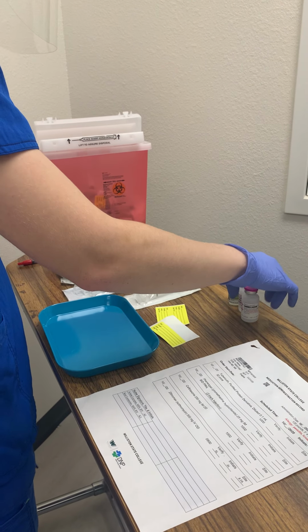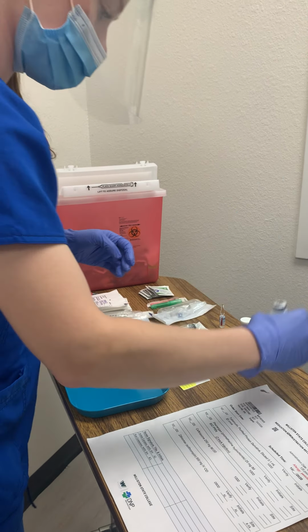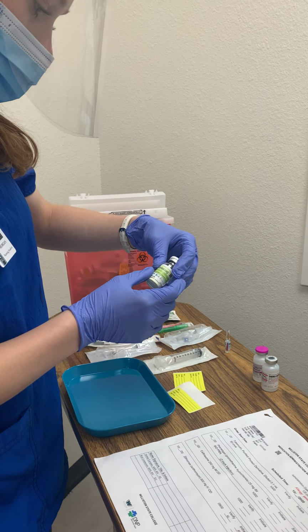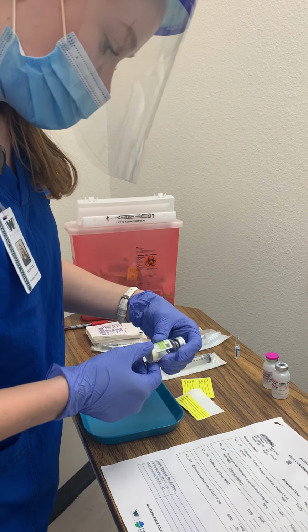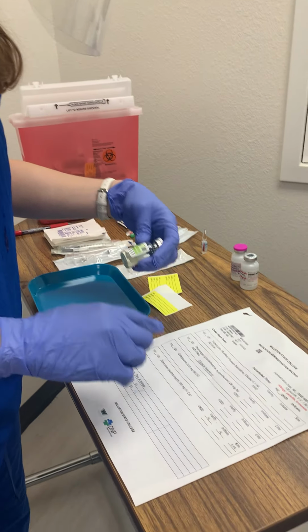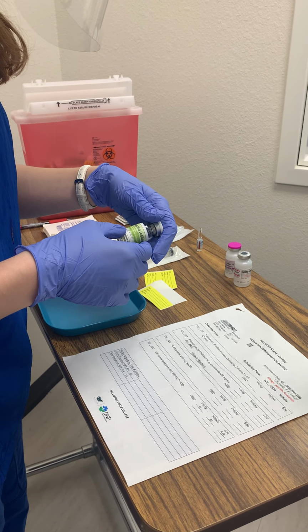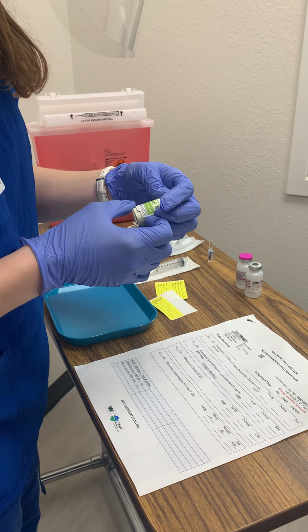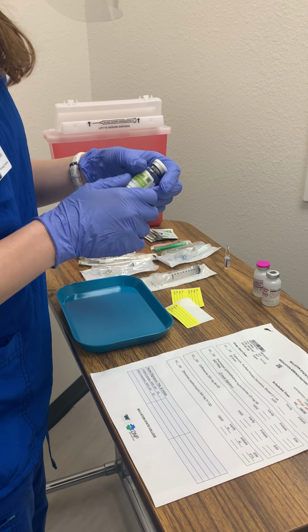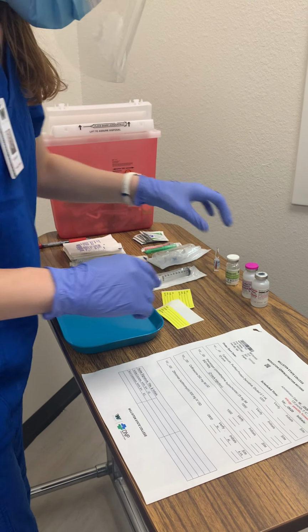My cap fell off, but that's because I had to fill my meds, so we'll just pretend that didn't happen. First, I'll be looking at my ceftriaxone, and so that's 250 milligrams, perfect, for 10 mL of sterile water to be reconstituted, perfect. And then it will be the 0.5 mL, perfect. The expiration date in 2023 is good, there are no cracks or discoloration, and Shirley Koss at 10 a.m., so perfect.